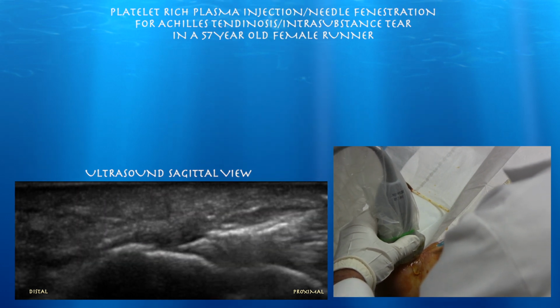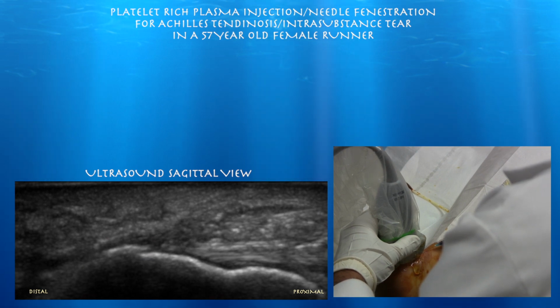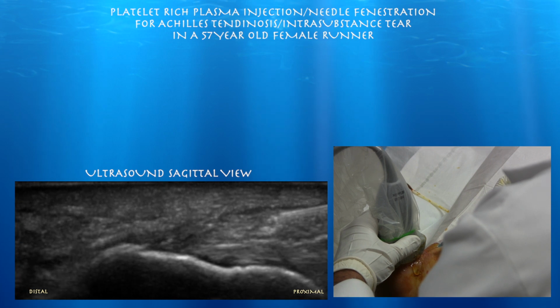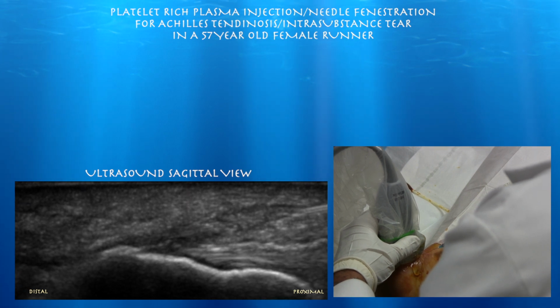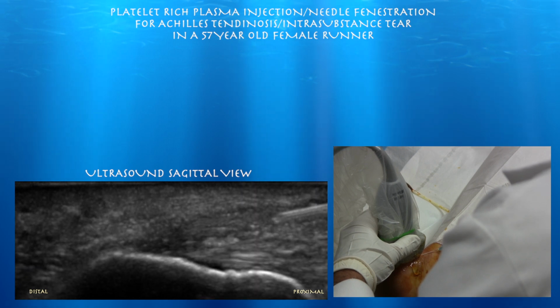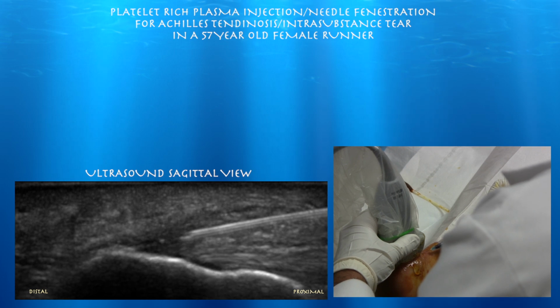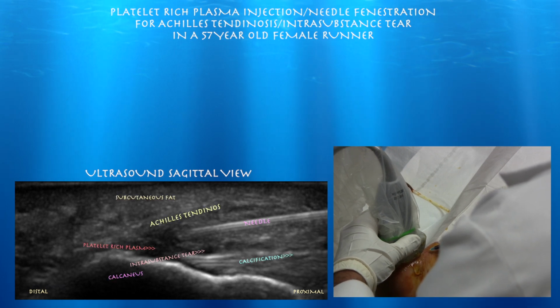We're going to do on top of the tendon. So here's all that bright signal, which is essentially your PRP filling up that distal Achilles tendon. And also that intrasubstance tear becomes more apparent as you inject PRP into it. Almost done.